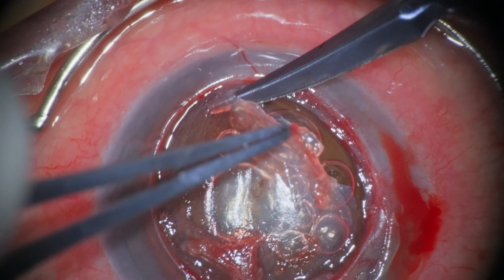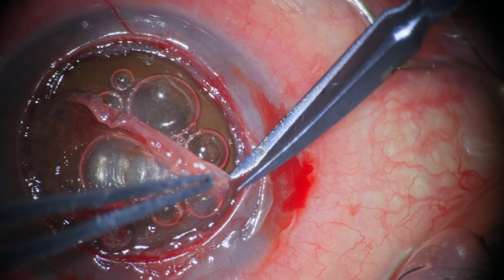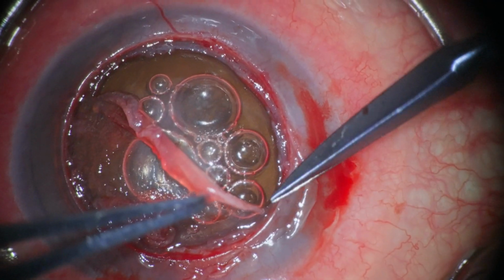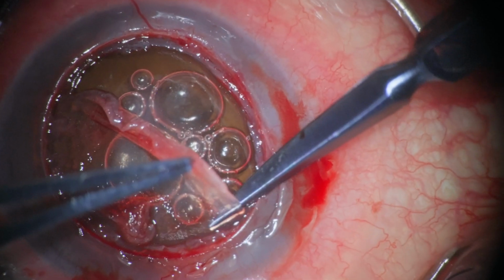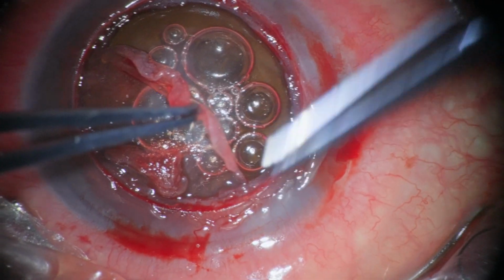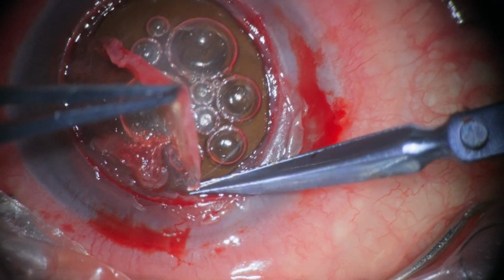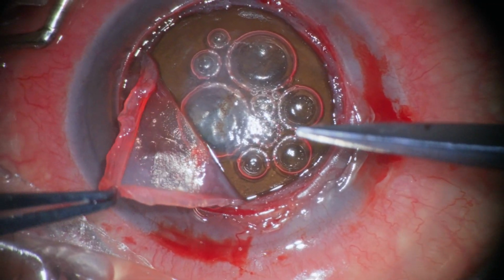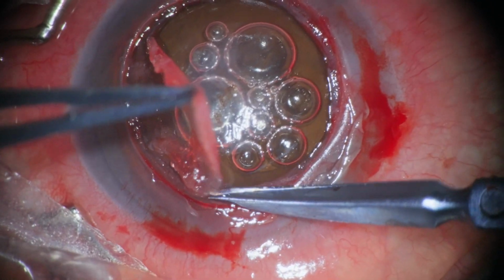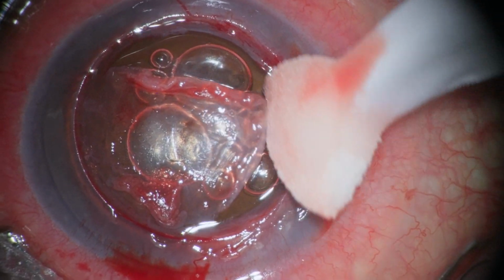Descemetic plane means that we're dissecting what is basically a type 2 bubble, if we were to have injected air. But we did not inject air, we just manually bared Descemet's. The way to know that it's Descemet's and not just another layer of stroma is by its texture. If it's rough, it's probably stroma, and if it's very smooth, it's probably Descemet's. The way that it peels off is also a convincing argument that it is indeed Descemet's. Descemet's is very easy to break, and this is what we've done here.